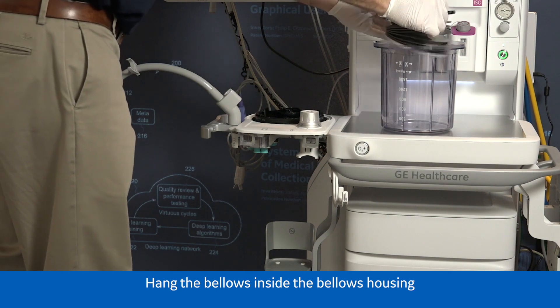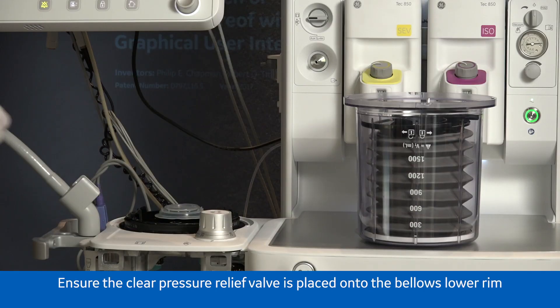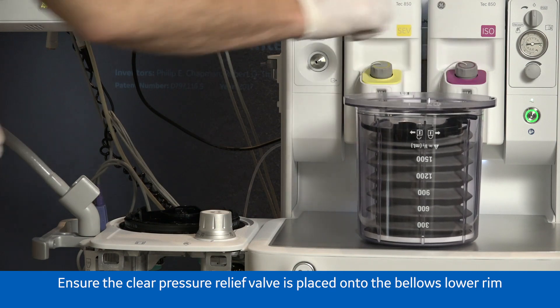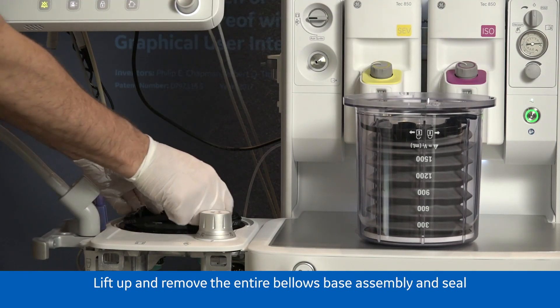Hang the bellows inside the bellows housing. Ensure the clear pressure relief valve is placed onto the bellows lower rim. Lift up and remove the entire bellows base assembly and seal.